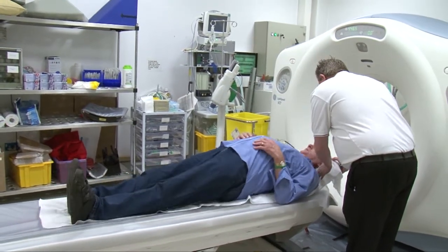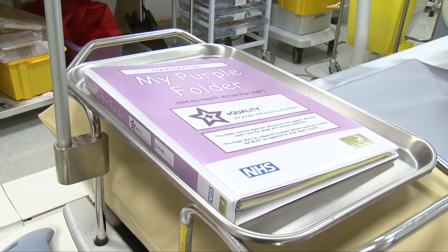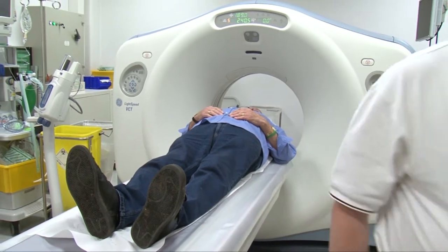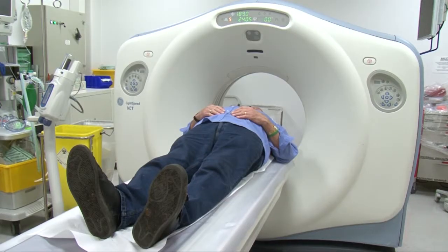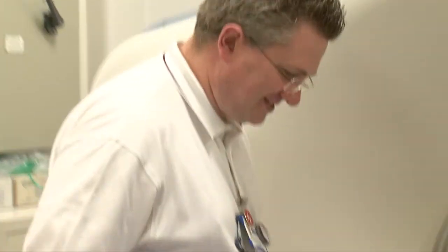Robert will lie down on the couch in the middle of the scanning machine. He may hear some noises and the radiographer's voice as the scan happens. The machine will move back and forth, and he will have to lie really still and relax. Just for a short time, he'll be left in the scanning machine on his own.